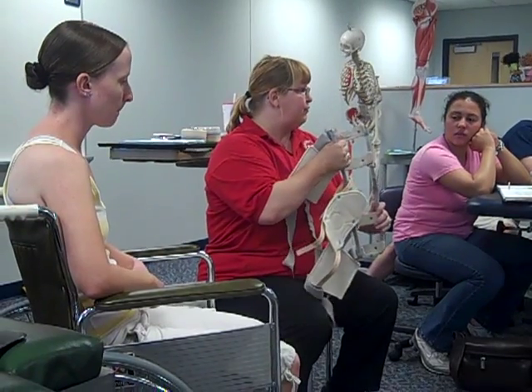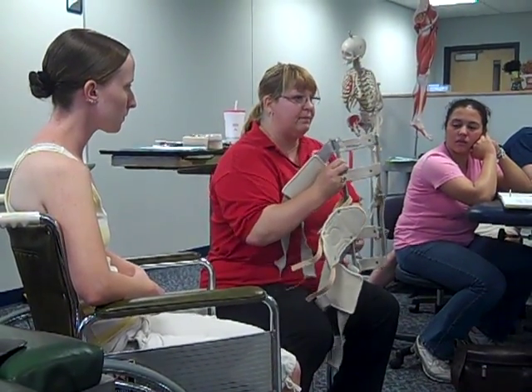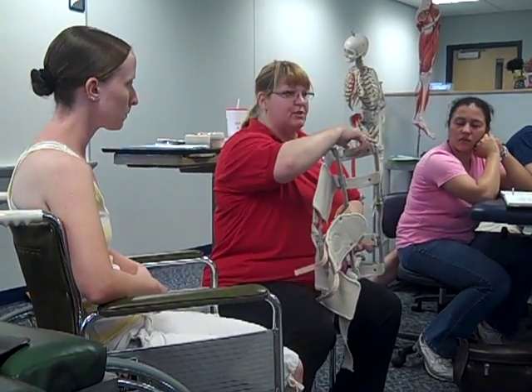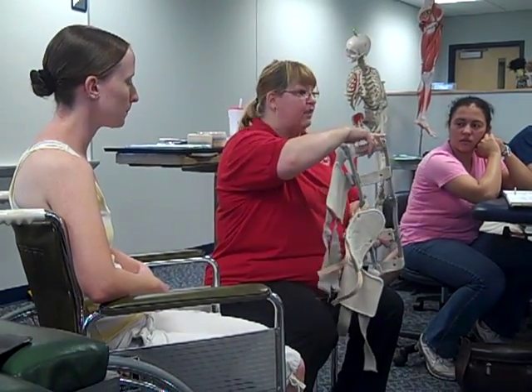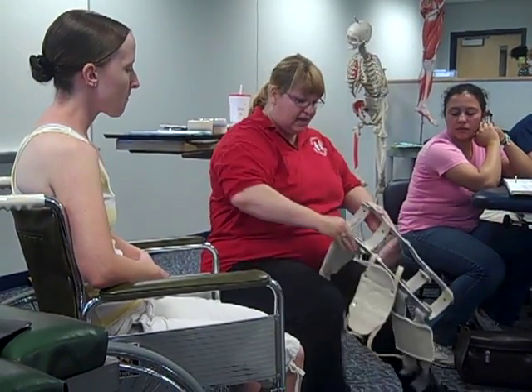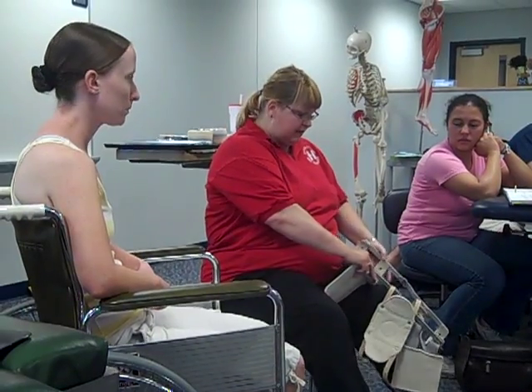It does make a difference left versus right. The buckles are on the outside, so this is going to be on her left leg. You wouldn't want the buckles against the person's other leg, so buckles always go on the outside.